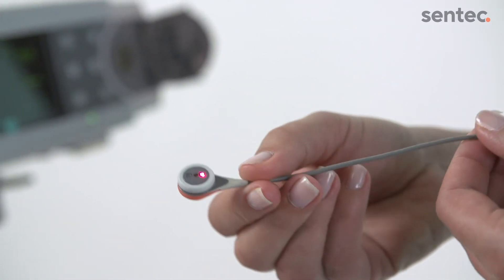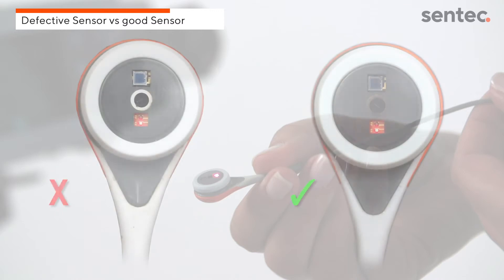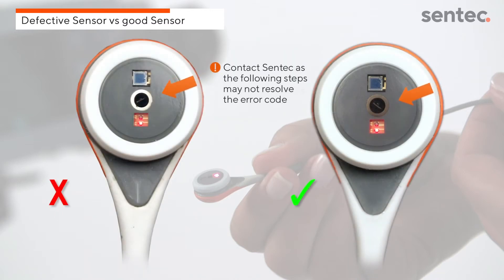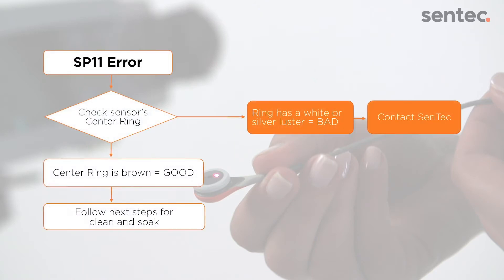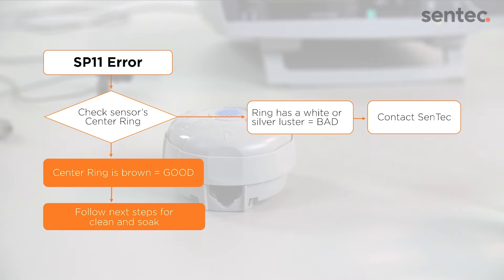Please contact Sentec if the ring has a white or silver luster as shown on the left sensor. The following steps will not resolve the error message. If the center ring is brown and intact, follow the next steps for a clean and soak.